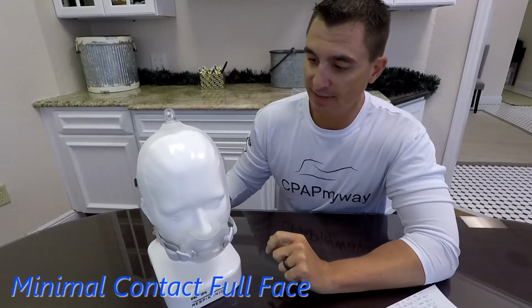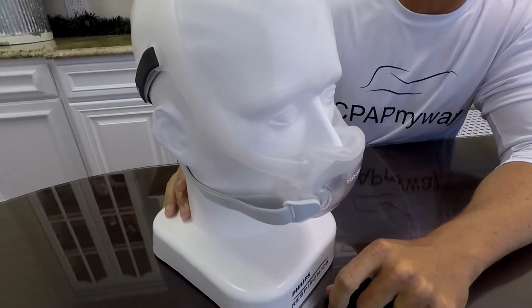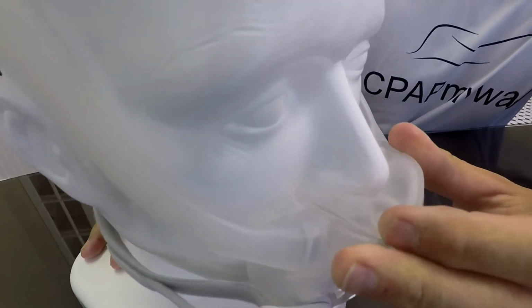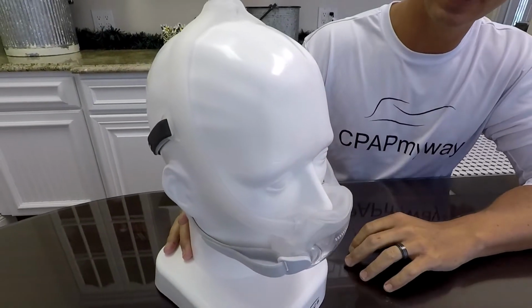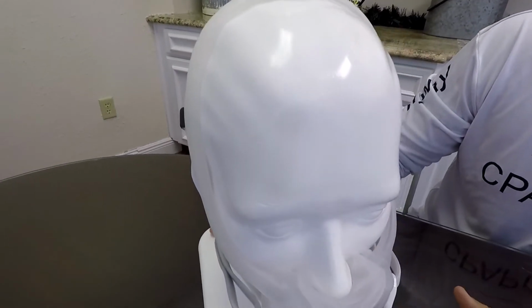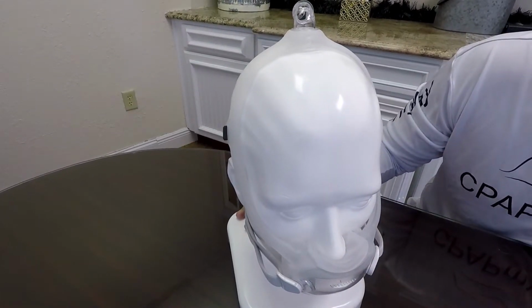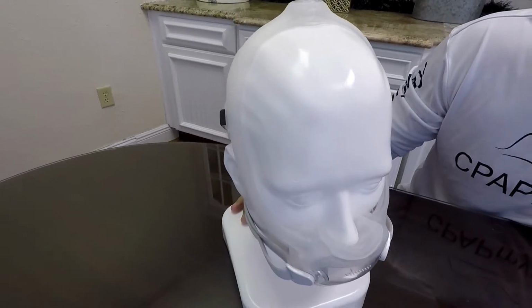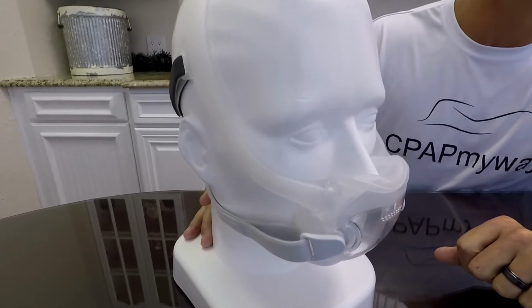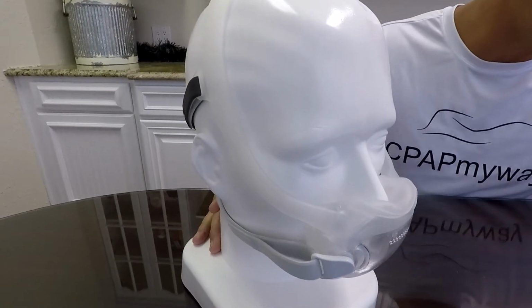So the last one we're going to discuss is the minimal contact full face style. This is one of a few that are out. This is the Respironics Dreamwear full face. You'll notice that it rests underneath the nose as opposed to across the bridge of the nose. And that's what gives it the minimal contact definition. This is a great mask for people that are mouth breathers but really don't want the rest of the gear up over the nose. It's also great for people that maybe watch TV before bed or wear glasses, because all of them have a nice open bridge of the nose area where you can wear glasses.